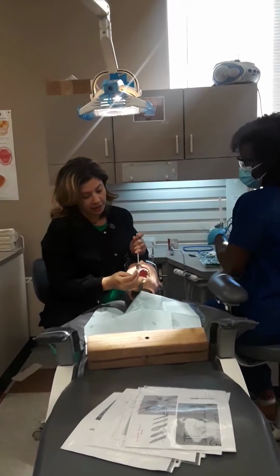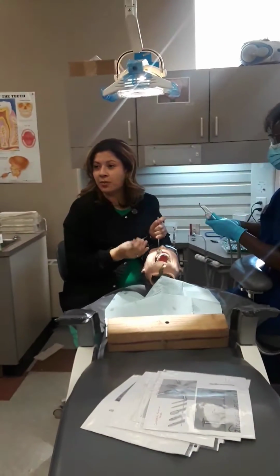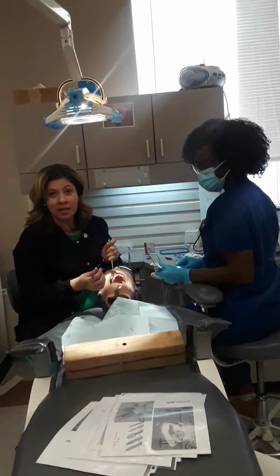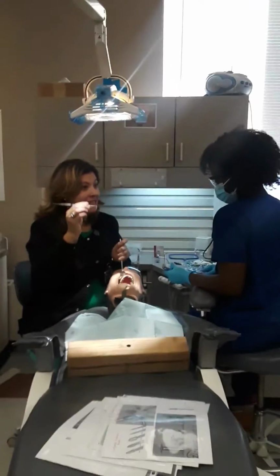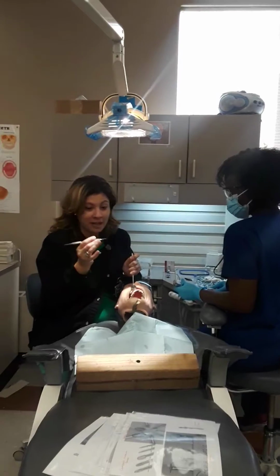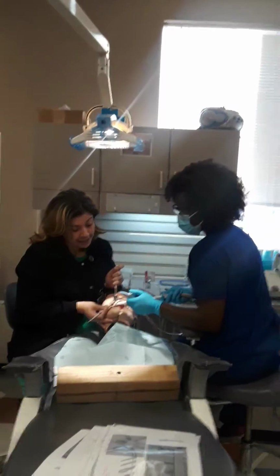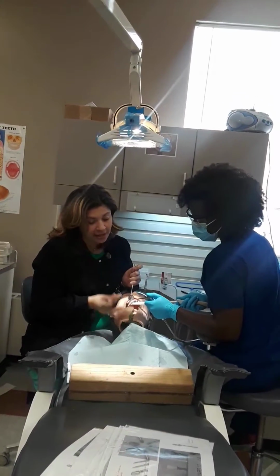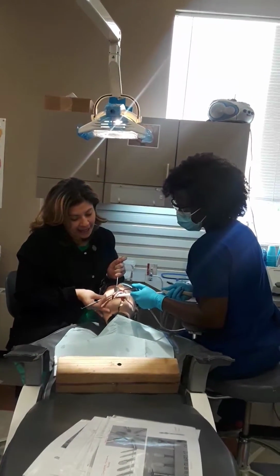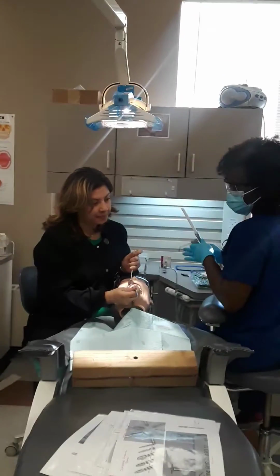Next up should be spoon excavator. So in an office, this will change. Most of the time, the doctor will cut all the decay out with a handpiece, and you probably will never even pass this. But just so you know, that must mean there's some decay still left, that my handpiece will take too much tooth structure away, so I need to remove it by my hand. And you pass this. That's why you pass that.